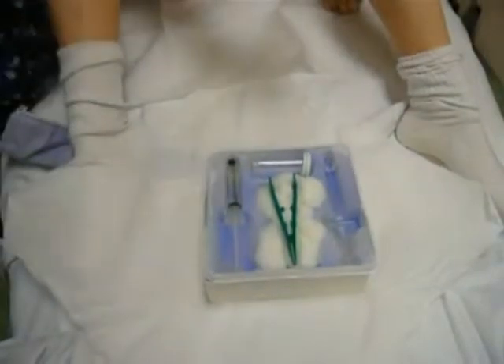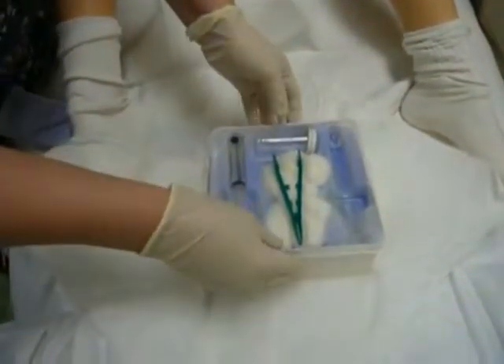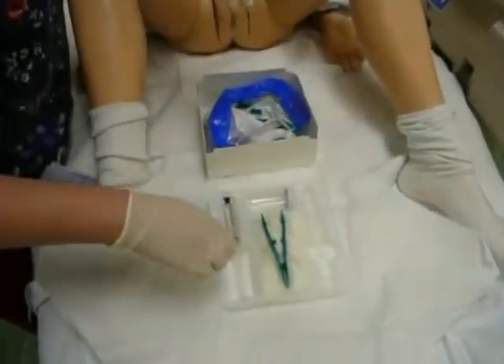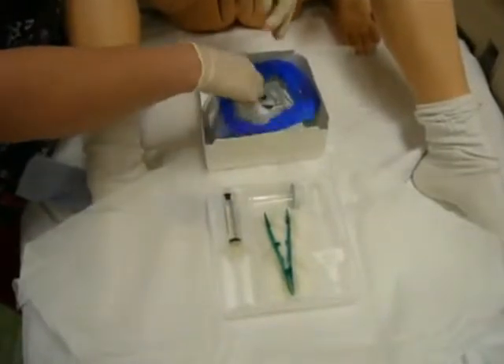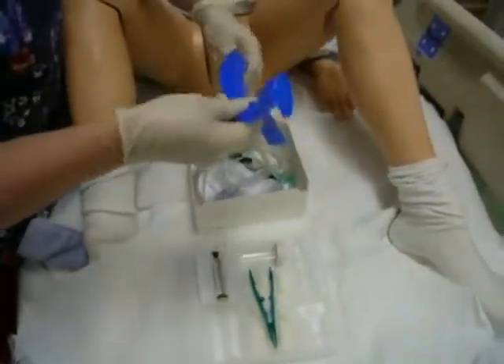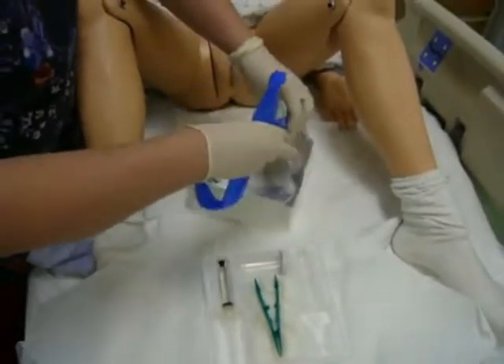That goes back over my garbage. Now I'm going to separate my two fields out — I have my catheter box and I have the cotton balls and the syringe with water to inflate my balloon. The catheter in the container has a blue sterile covering over the sterile catheter.